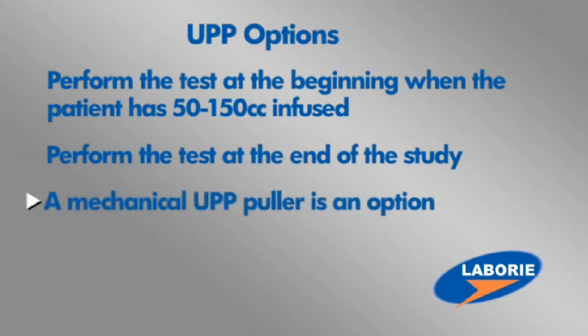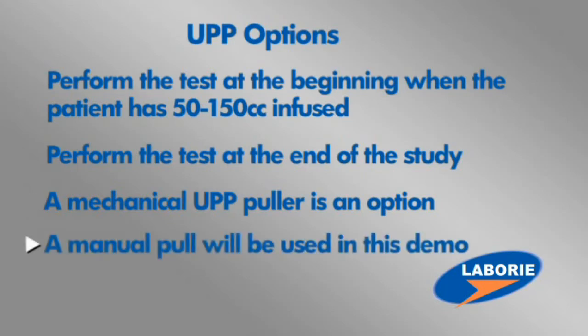Some offices choose to use a mechanical puller to do their pulls. This is an optional component of the GOBI, but for the sake of this video, we'll describe how a manual pull is commonly done.